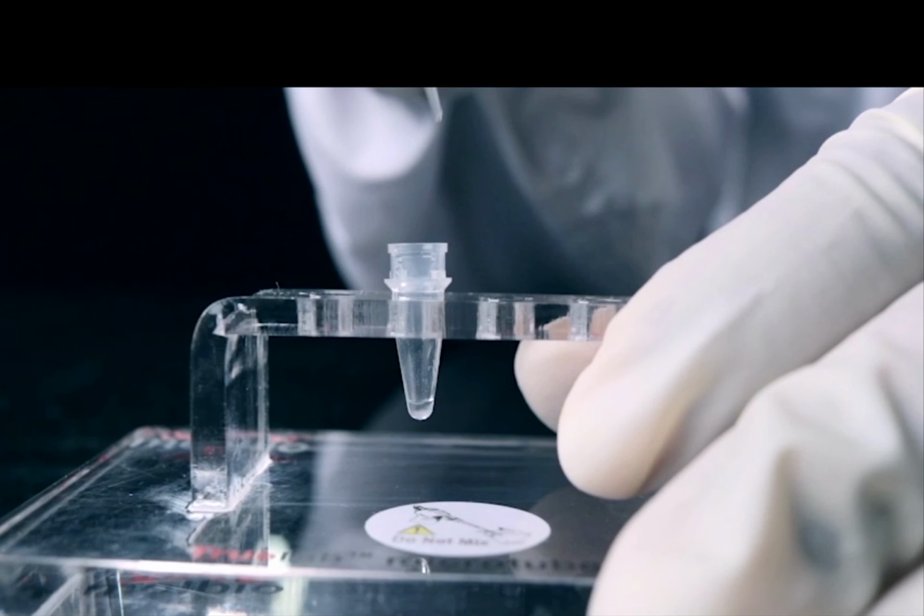The most important thing here is you have to keep the pipette in your hand. Don't discard the tip. There is only one tip, so please don't discard the tip. That is the most important. So many times by mistake he discards.